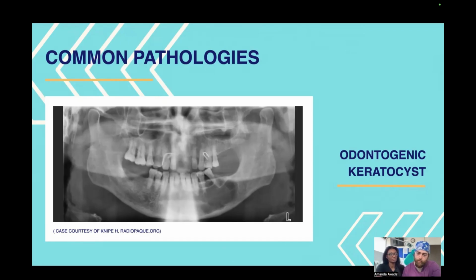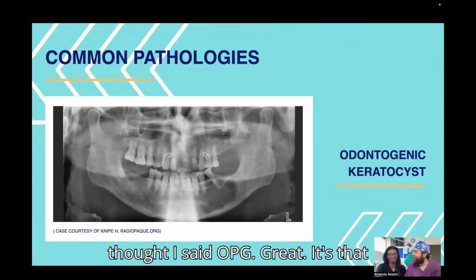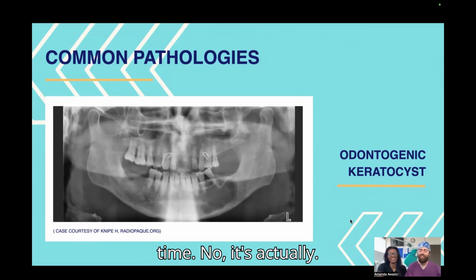You said bite wing though. Huh? You said bite wing. I thought I said OPG. I know. It's that time of the day.